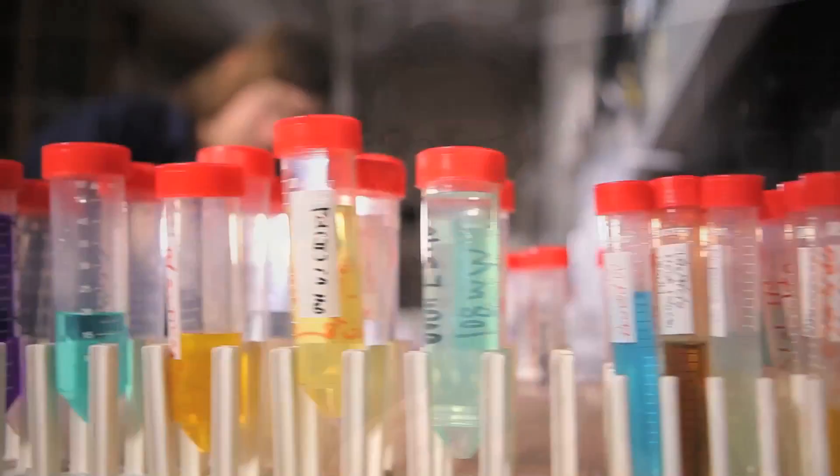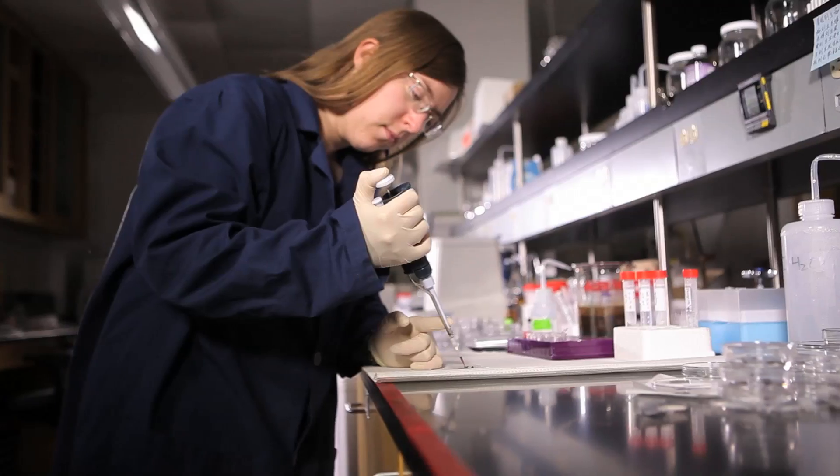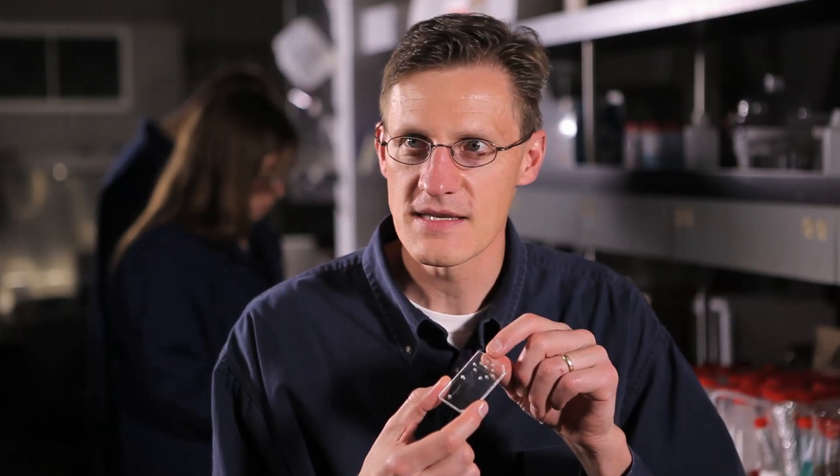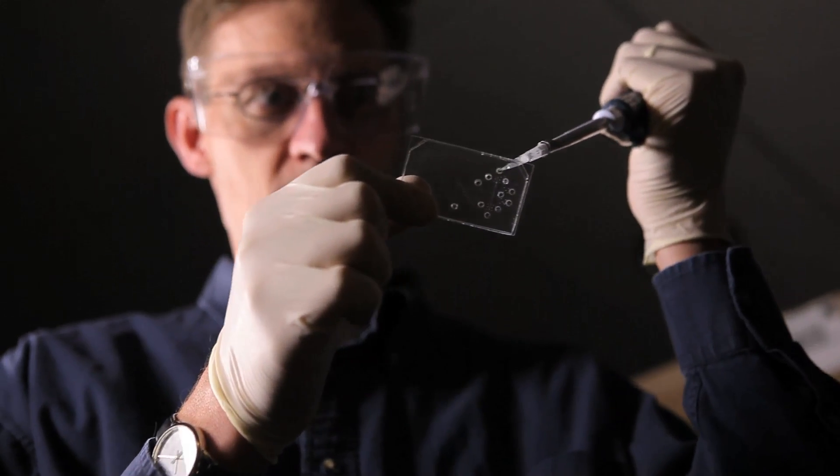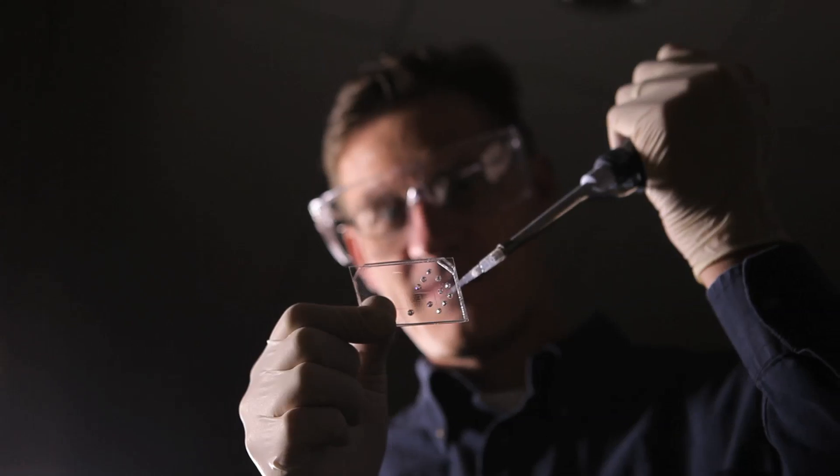Those molecules could be proteins related to cancer or something like that. Unlike what's done presently, when the doctor obtains a blood sample and sends it away for testing and it takes a couple of days to obtain the result, what we hope can happen with this device is that we could take a very small sample of blood with just a finger stick, put it on the device, and be able to get a result in terms of the concentrations of proteins or other molecules that might be related to disease in a matter of minutes. You could then discuss those results directly with your doctor during your visit.